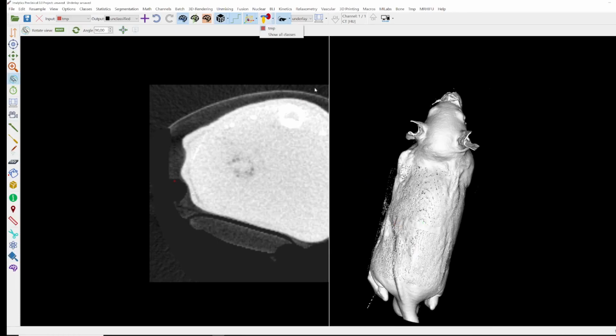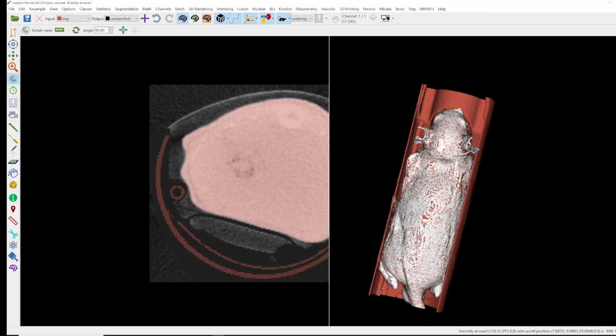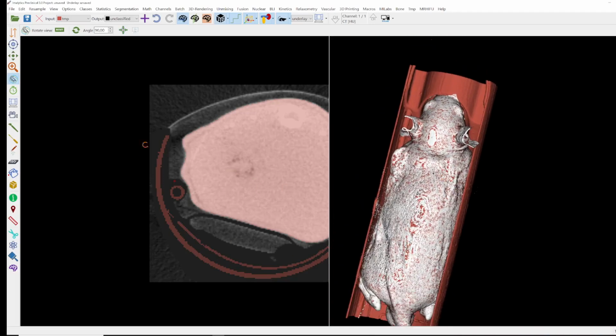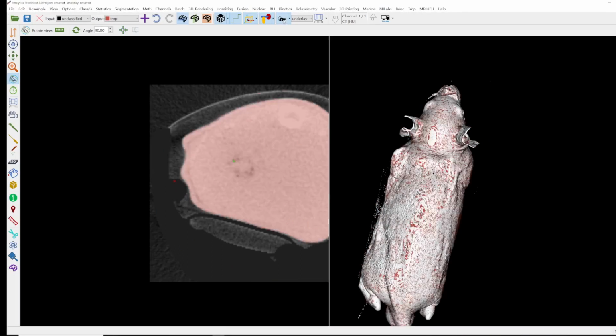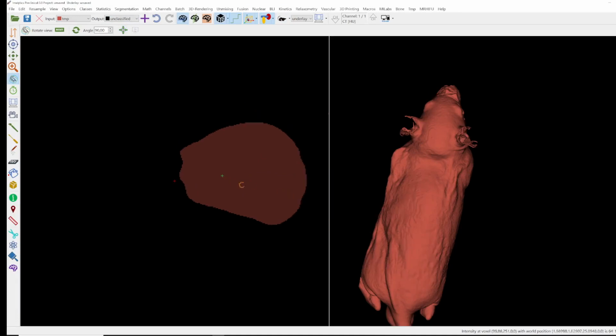Now we can show our temp segmentation again, and now we can perform a fill region. Let's delete the temp segmentation because the removed parts are also segmented. So let's delete the temp and generate it new. Again, the thresholding above 400, minus 400. Let's remove the components again, as I did it before. Find components with 1. And now we can perform a fill region.